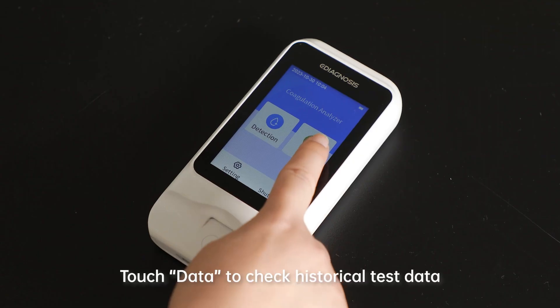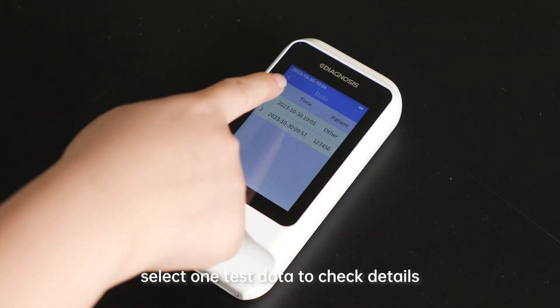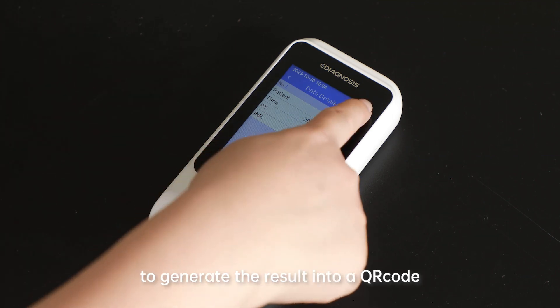Step 9: Data review. Touch Data to check historical test data. Select one test record to check its details. Touch the QR code in the upper right corner to generate the result as a QR code.